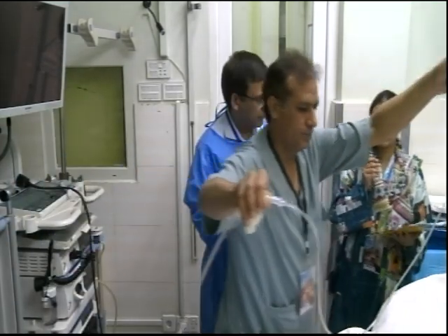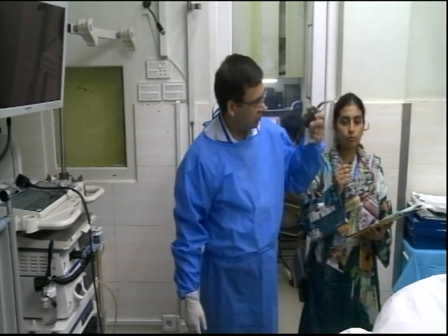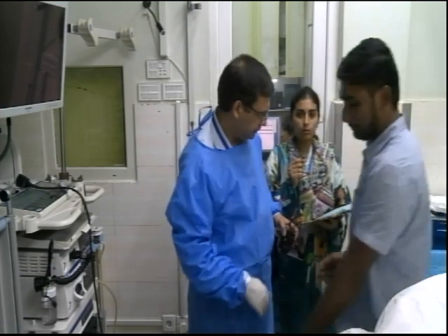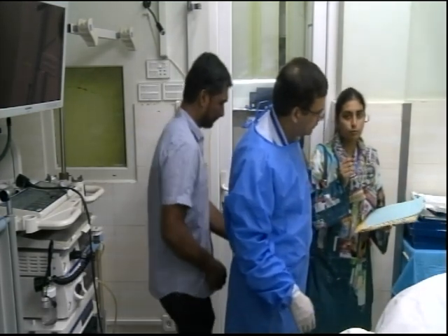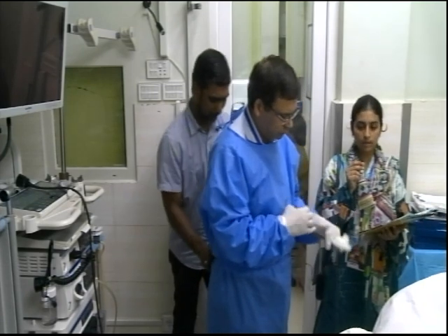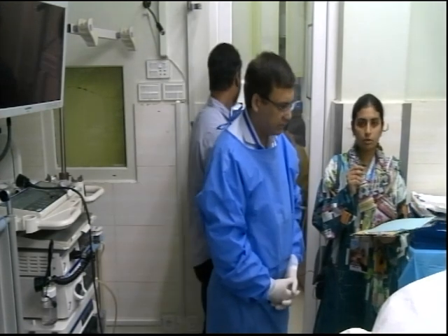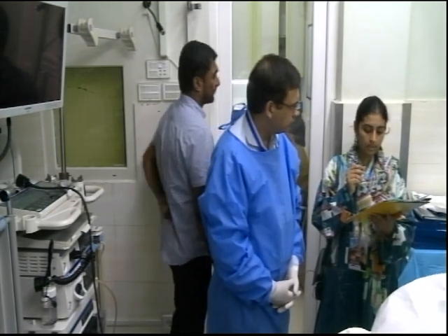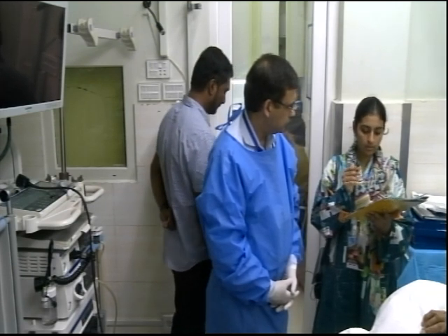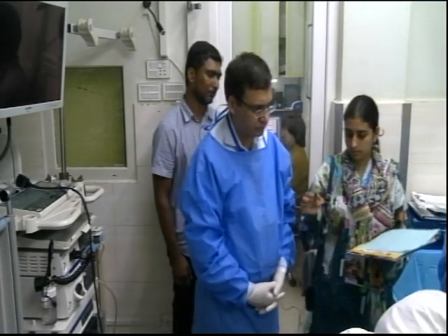This is a 53-year-old female patient who presented to us with a history of on-and-off PR bleed for 1 year. At that time, there was a rectal growth of which a biopsy was taken. It was poorly differentiated adenocarcinoma. She had taken neoadjuvant therapy, 6 cycles of chemotherapy. Now she's here for restaging of her cancer. Her CT scan shows thickening of 3 centimeters starting from S3 to S5 level, 5 mm in thickness, in the anterior wall of the rectum.